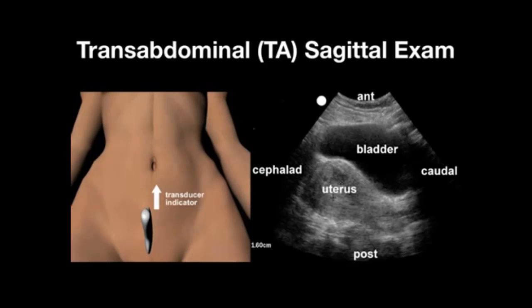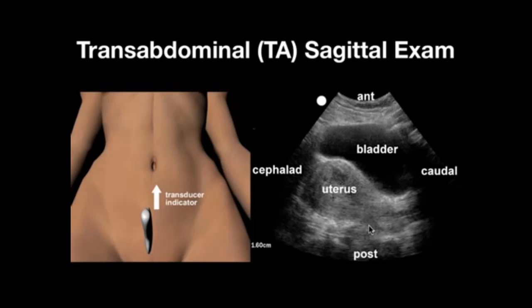For the transabdominal sagittal exam, the transducer is placed in the sagittal plane with the indicator directed toward the patient's head, just cephalad to the pubic symphysis. This gives you an anterior-posterior, head-foot orientation. In the near field you'll see the urinary bladder, often with reverberation artifact. Here you can see the antiverted uterus, the myometrium, and the hyperechoic endometrium. The posterior cul-de-sac wraps around into the anterior cul-de-sac.